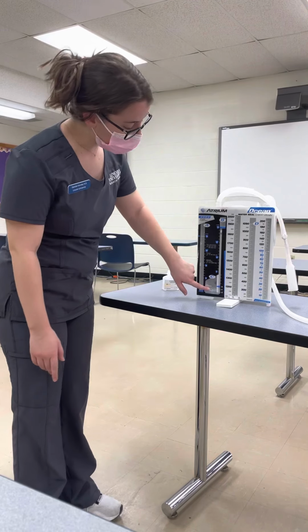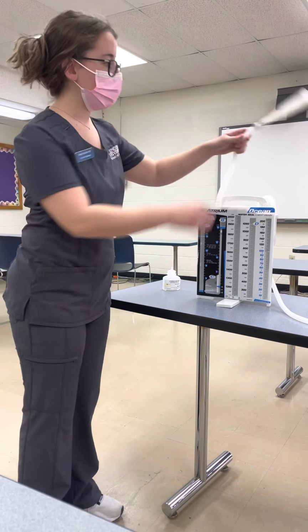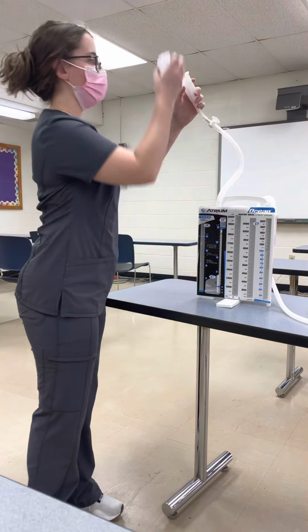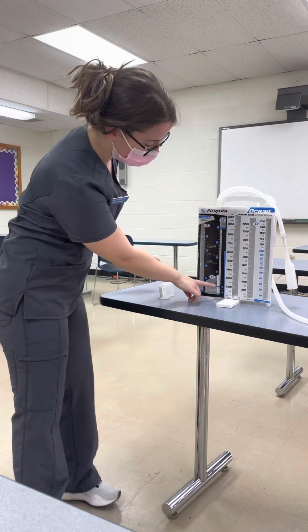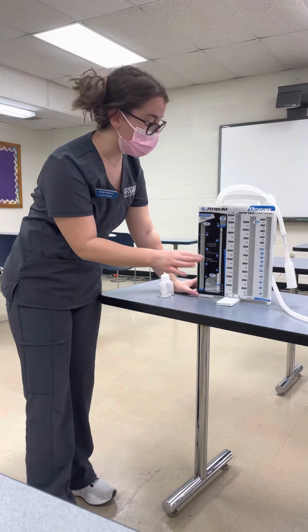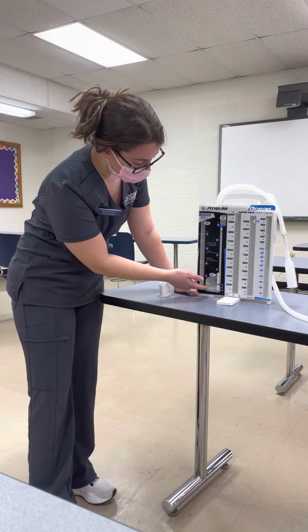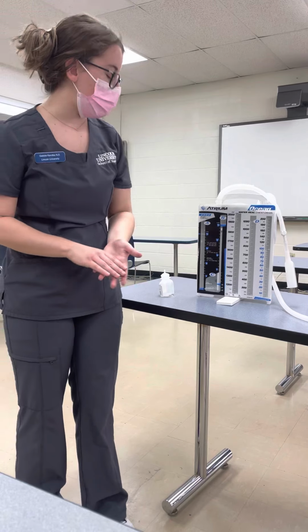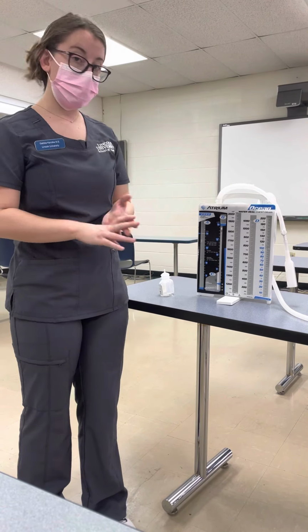The next chamber we have here is the water seal chamber. Here is the funnel that you would put the water into, and you would make sure to fill up the water to at least this 2 centimeter mark. That is the standard amount that you should put in the water seal chamber, and this will tell us if we have tidaling and air leaks. So tidaling is normal.